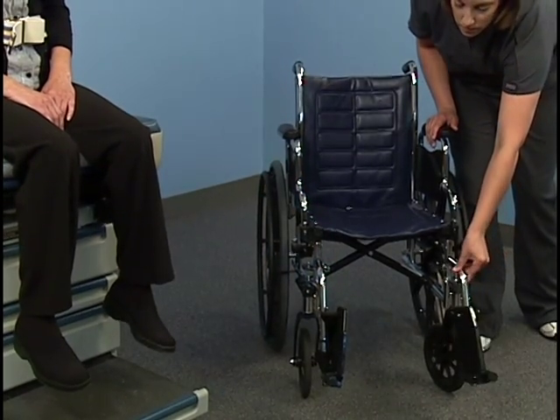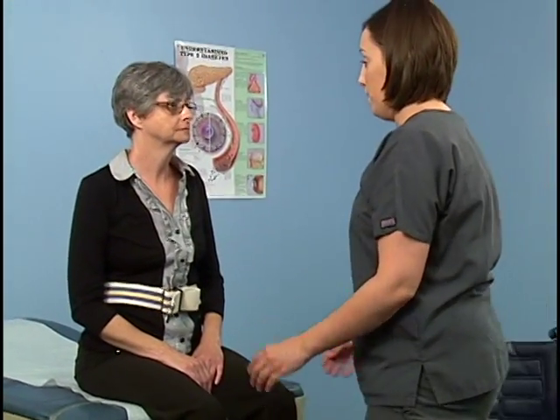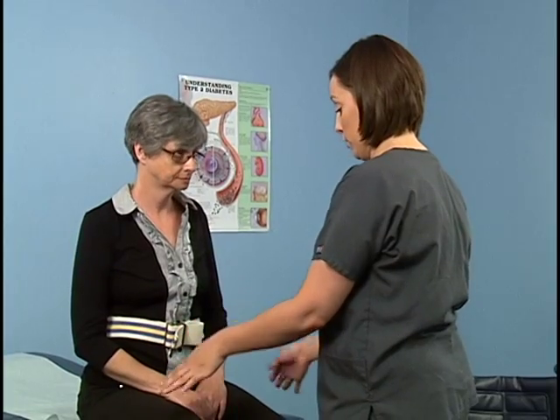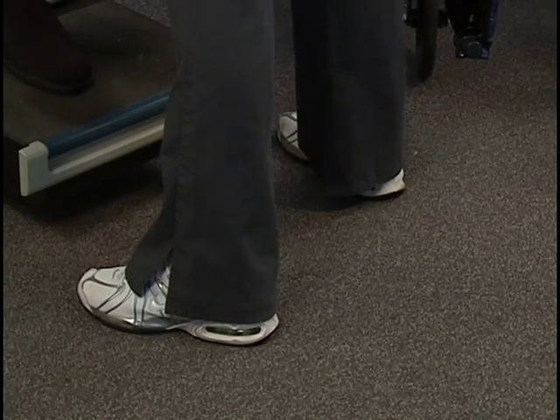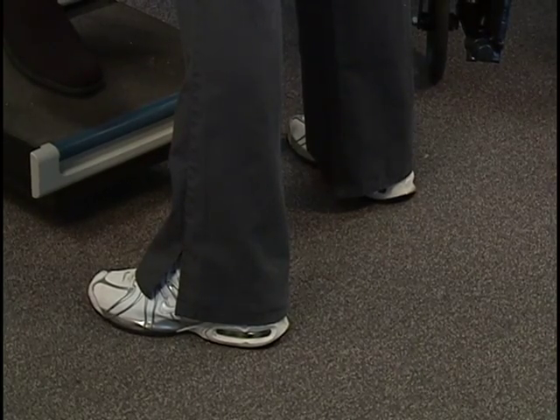Inform the patient about what to do during the transfer. Ask the patient to place her arms on your shoulders, but not around your neck, as this could cause an injury. Stand in front of the patient with your feet apart, one slightly in front of the other and knees bent.